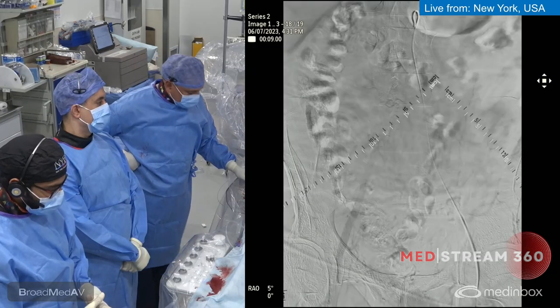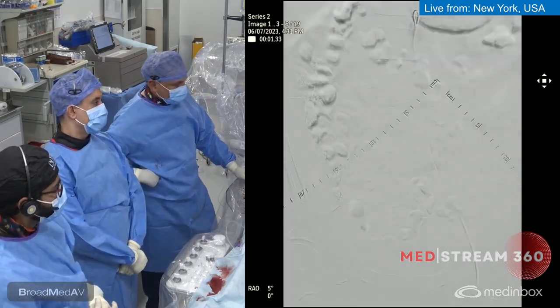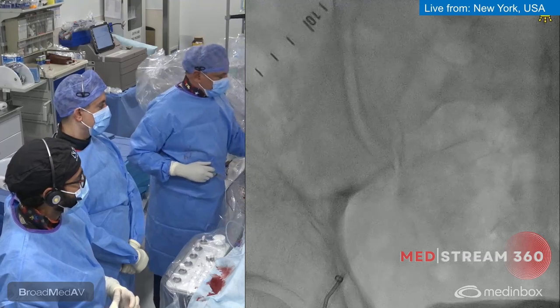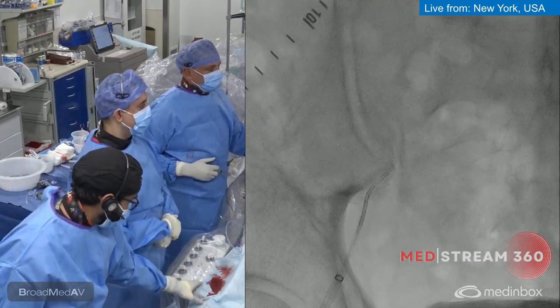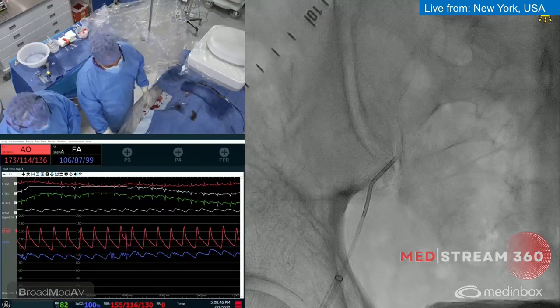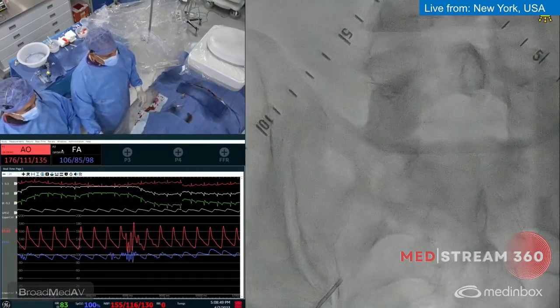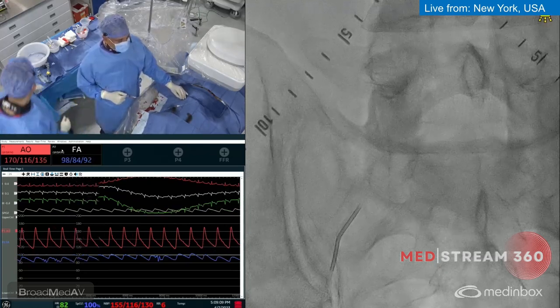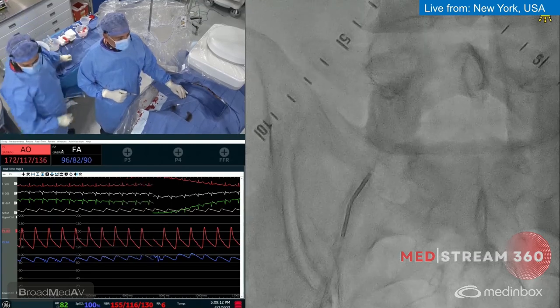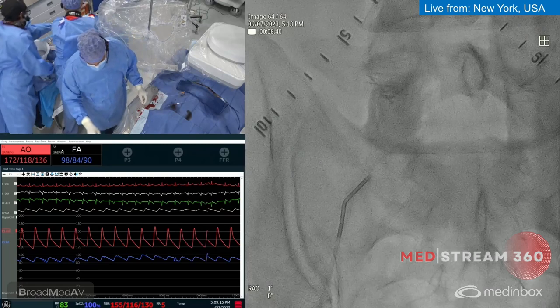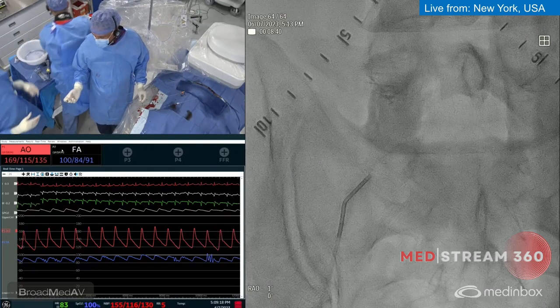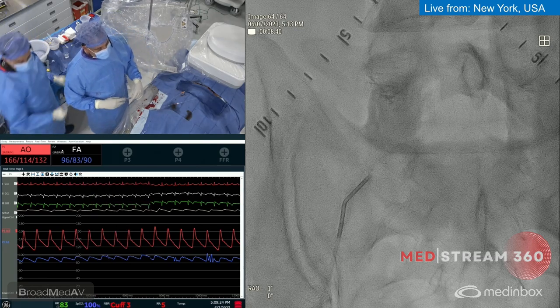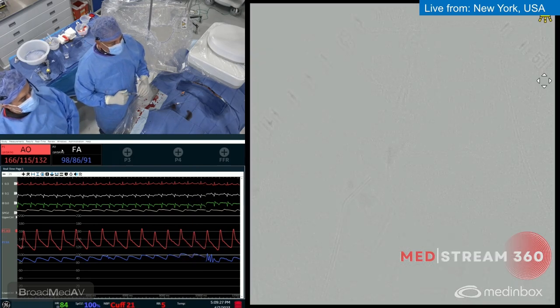A lot of times there's significant hibernation in these vessels, similar to what we see in tibial work. I'm advancing without a wire here just to confirm the occlusion — you can send a wire up or not. I know the internal iliac is medial so I'm going lateral here and injecting. Now look at this — you can see the level of hibernation very clearly. We're going to take another picture to confirm.